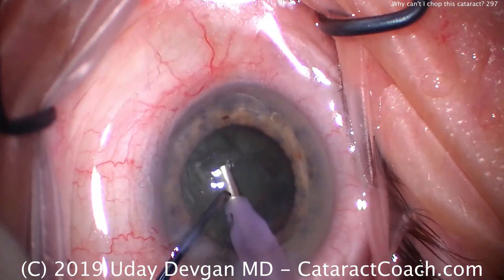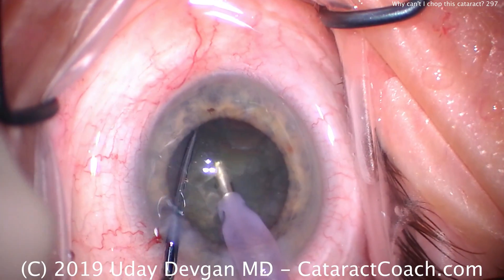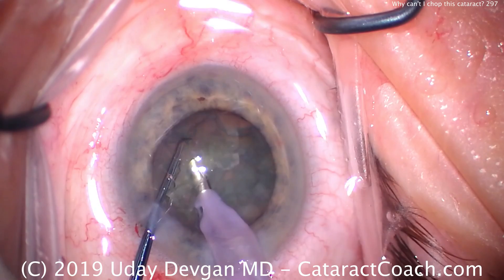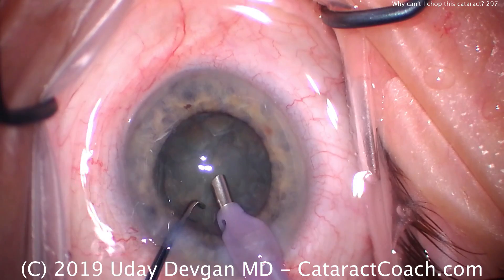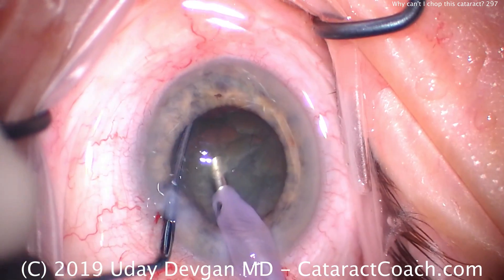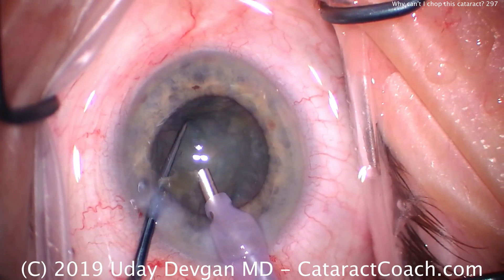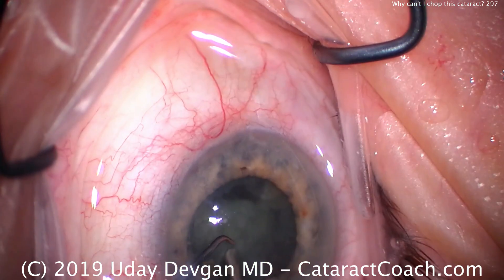Why is that? Everything seems normal. I'm on my normal settings, the eye anatomy seems okay, the lens isn't too dense. Finally I get a little bit of a chop there, but there's a lot more struggling than I'm expecting for this grade of cataract. Chopper goes around again and still not that effective at the chop. Buzz in one more time, finally we got a little piece off, and hopefully we can bring the rest of this nucleus up. The answer is staring me right in the face and I have yet to figure it out.